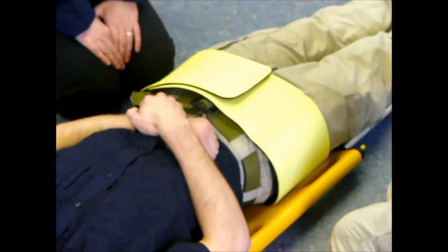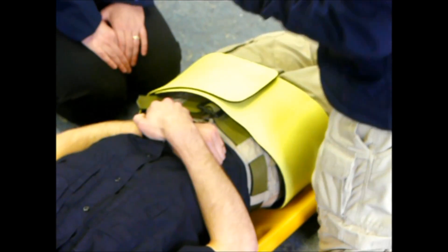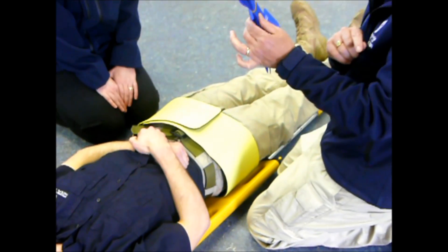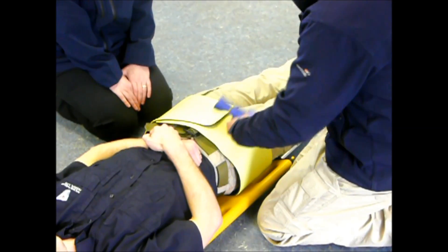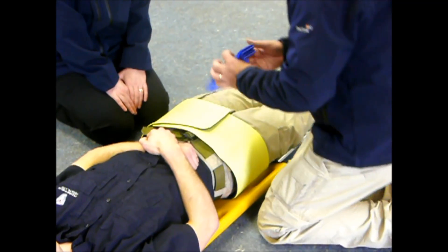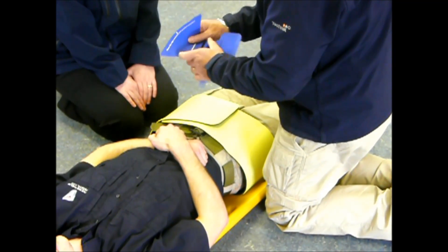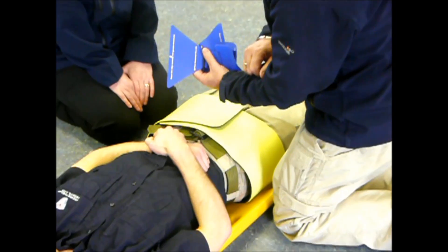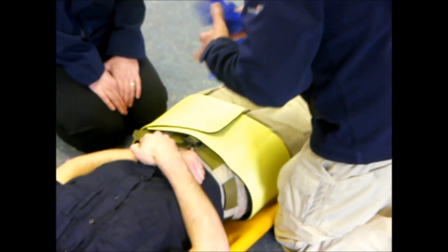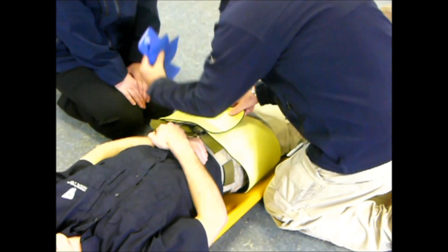We can now take the blue strap. The tip for this is to keep that elastic band around the strap, because this stops it inadvertently sticking to the belt while you're routing the strap. I'm then going to take one of the triangle anchors — as you can see, the arrow is over the greater trochanter — so I'm now going to place that on this side.